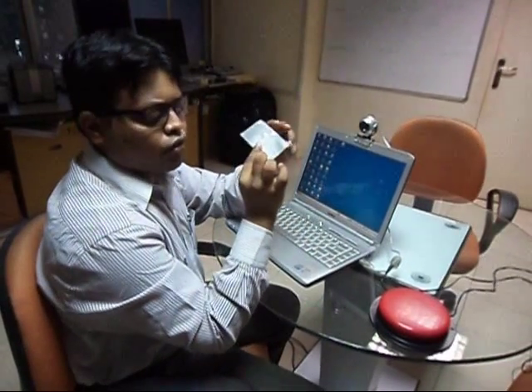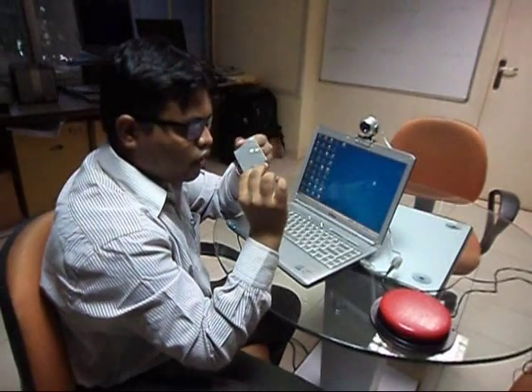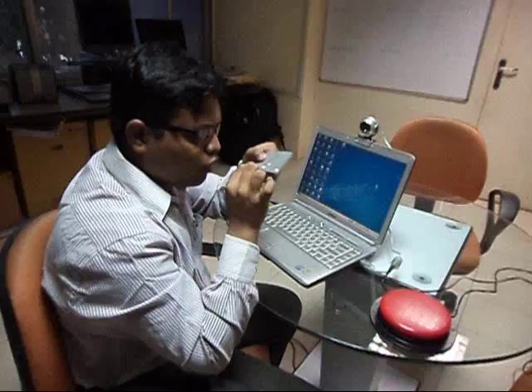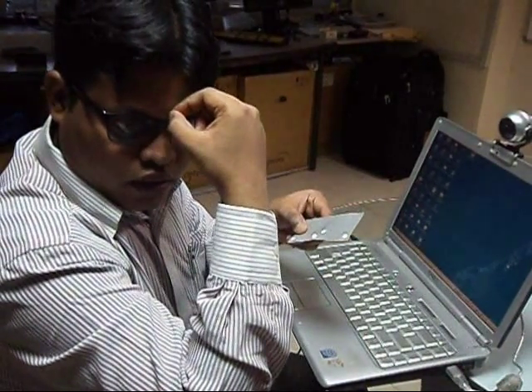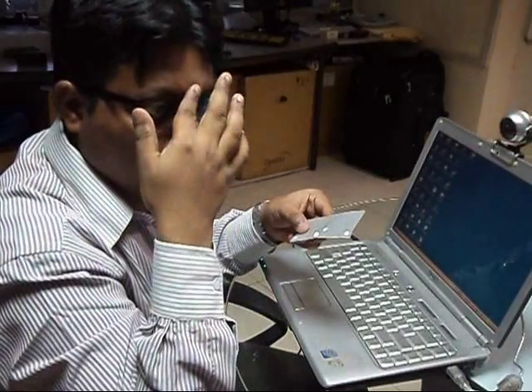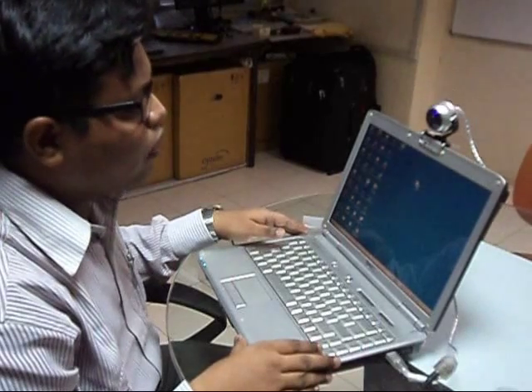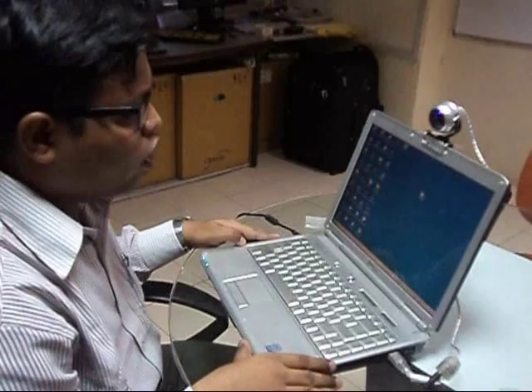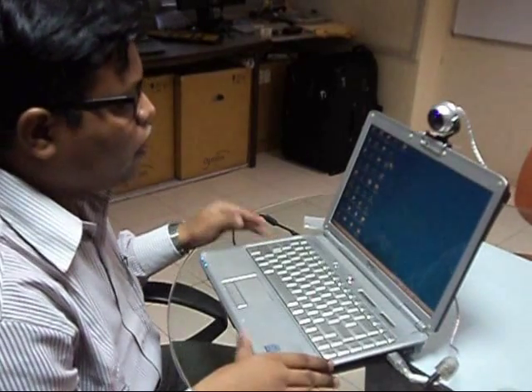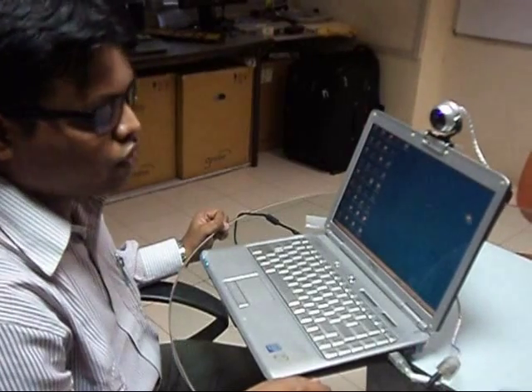It senses movements from one of these dots which you can place on your forehead or on the rims of your specs. I'll place one of these dots on my forehead, and when I look at the Tracker Pro, it has started sensing the dot and is simulating the mouse pointer on my computer screen. I just have to move my head and I can move the mouse pointer on the screen.